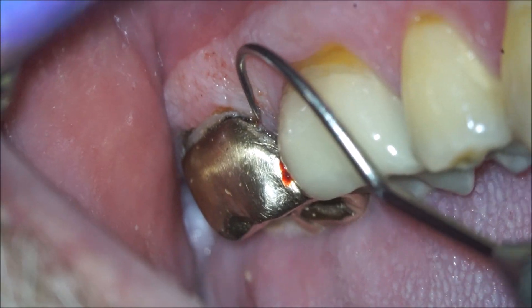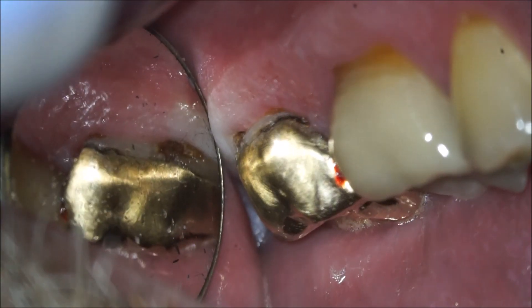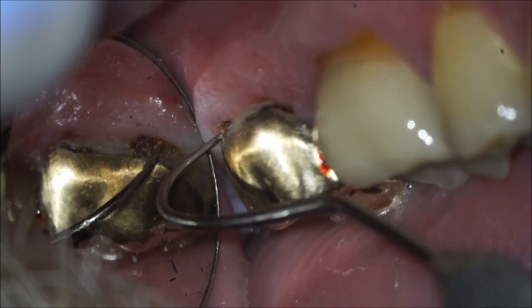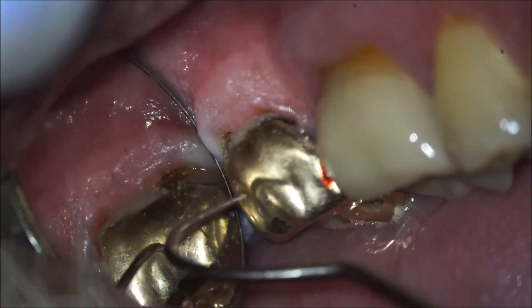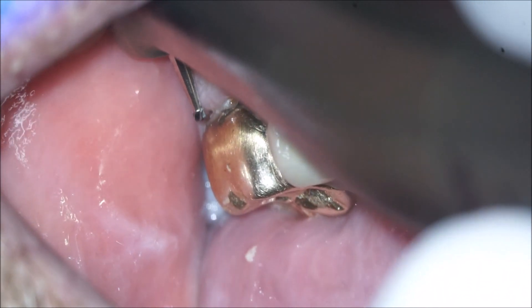I'm going to show a real basic procedure here. This is going to be an amalgam patch job under an existing full gold crown. As you can see, there's some pretty deep decay on the distal buccal. The mesial margin is failing, so we just need to go ahead and get this cleaned out, and then I'm going to patch it with amalgam.